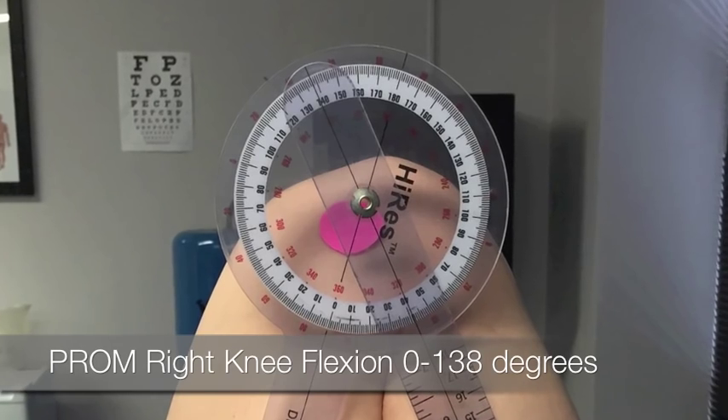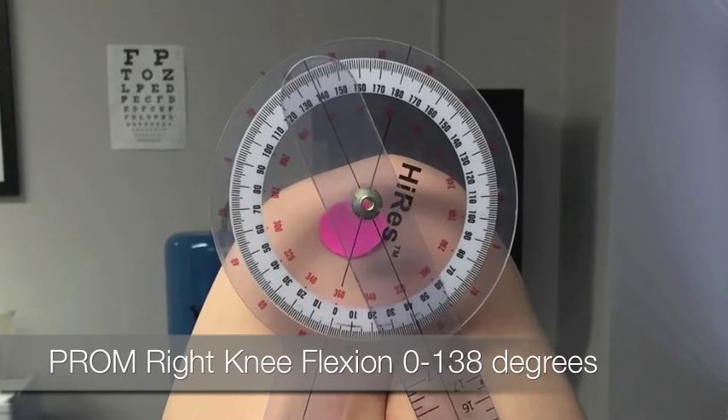Passive range of motion, right knee flexion: 0 to 138 degrees.